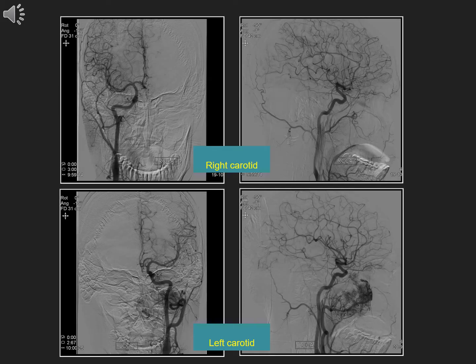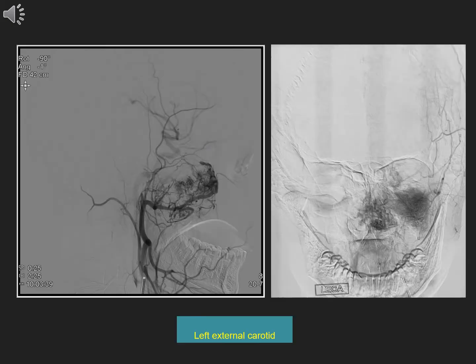A complete six-vessel angiogram was done. There was no supply from the right carotid, but extensive tumor blush was seen on left carotid injection. Selective left external carotid artery angiogram showed most of the tumor to have supply from its branches. A dense tumor stain was noted.